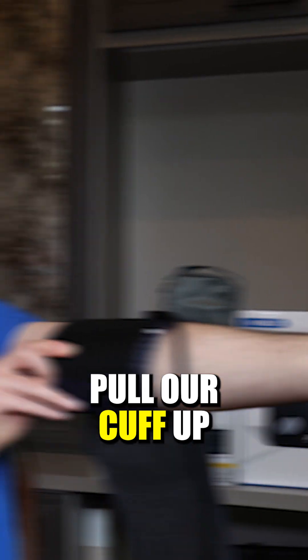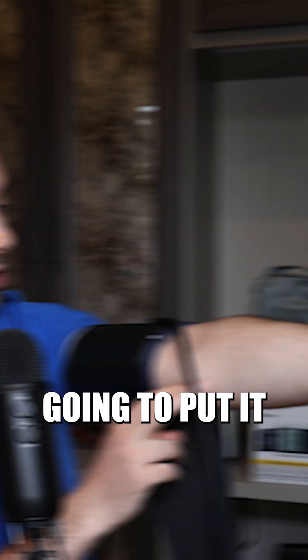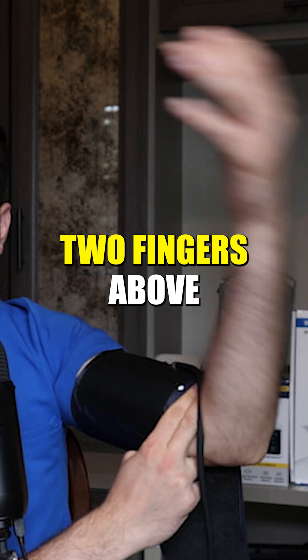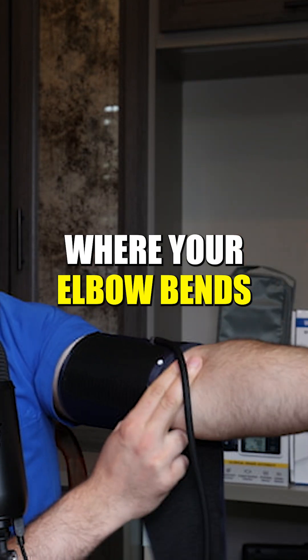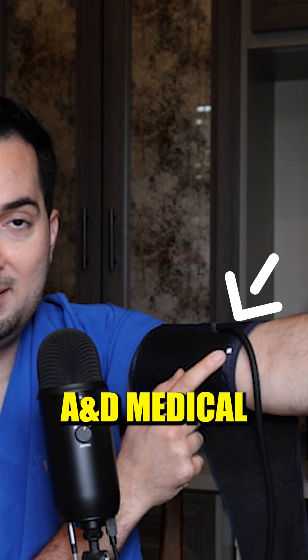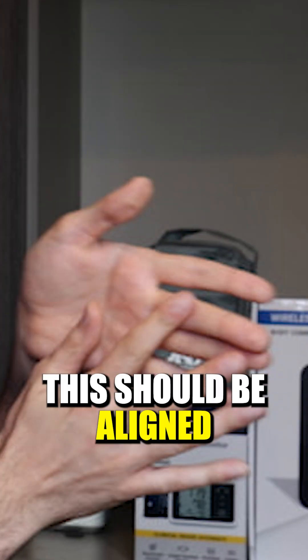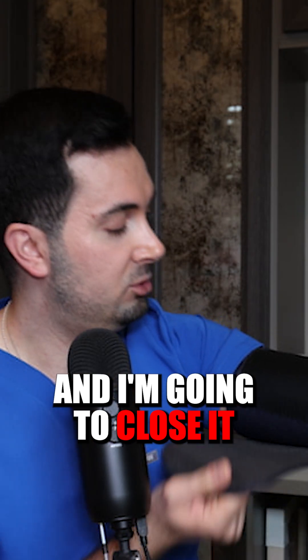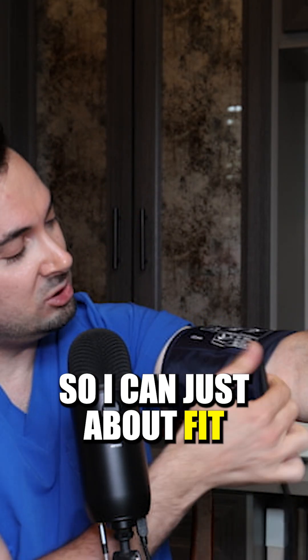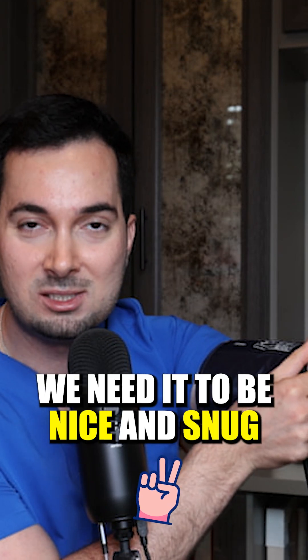Next we're going to pull our cuff up just onto the bicep and we're basically going to put it two fingers above where your elbow bends. Notice this white dot — all of our AMD medical blood pressure monitors have this white dot. This should be aligned with your middle finger, and close it just so it's tight enough that you can just about fit two fingers in there. We need it to be nice and snug.